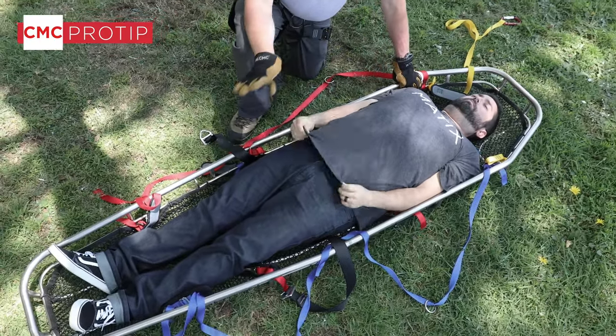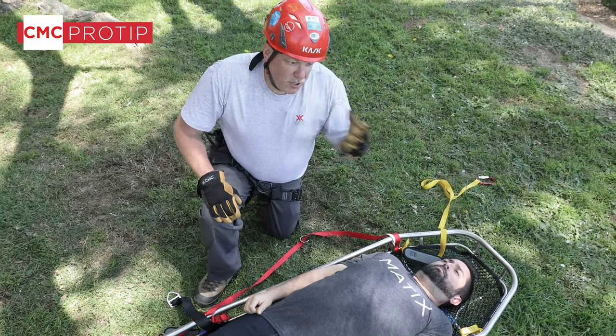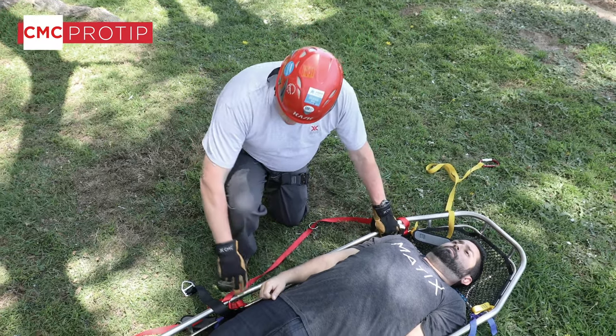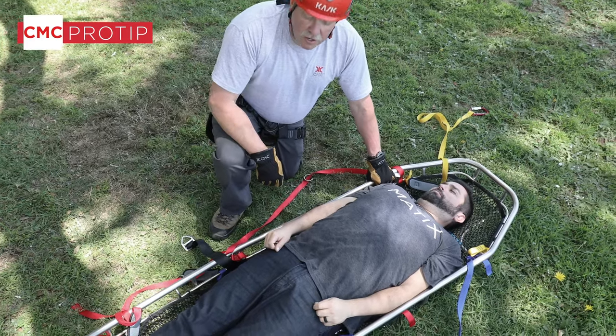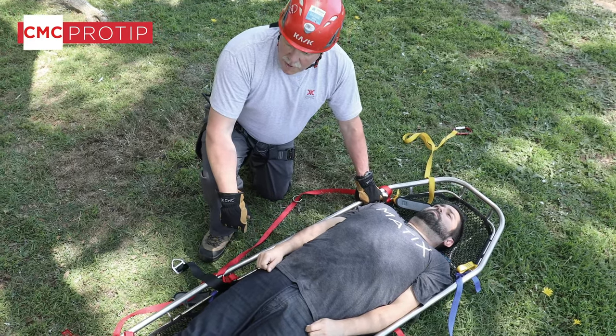It's important you follow your local medical protocols as far as patient immobilization and patient movement. We're just demonstrating the tie-in system and pelvic harness here — in a real situation we would be putting eye protection and a helmet on the patient. Also, you'll notice the basket is on very firm footing so the litter is stable while we're packaging him.